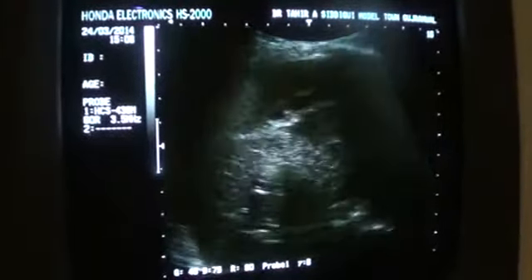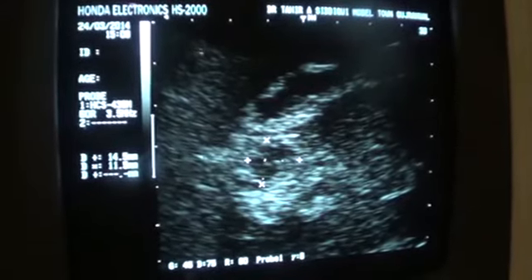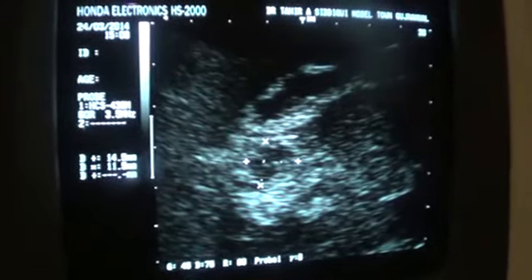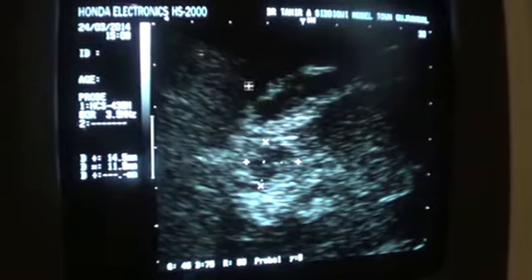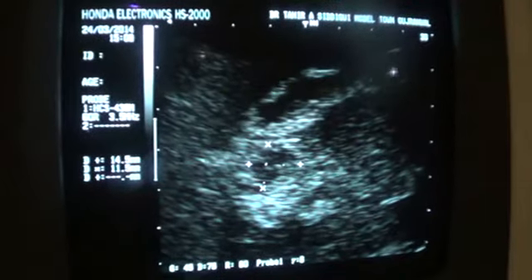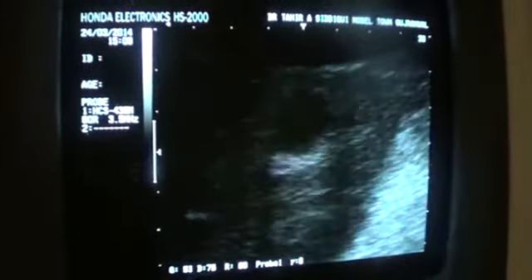Yeah, here, this one. Now this is again a cystic area surrounded by an echogenic rim, and is also at the visceral surface of the anterior segment of the right lobe. This is the falciform ligament. This is the fluid surrounding the outer surface of the liver. So at least two can be seen.